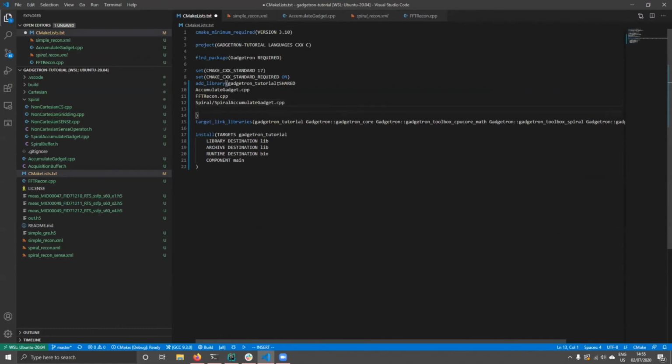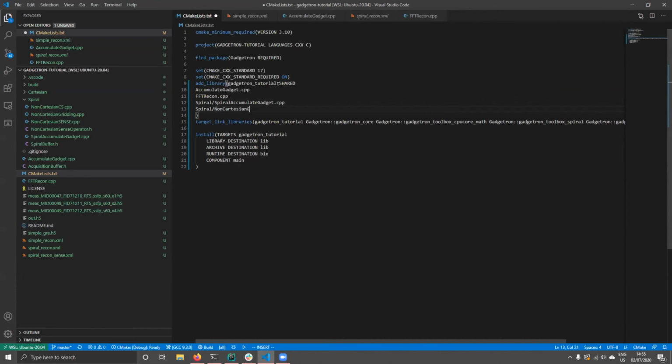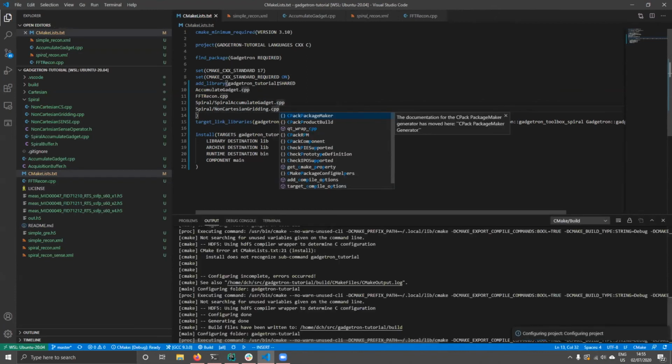For my day-to-day work, I would typically be using CLion rather than Visual Studio Code, but CLion is a pay-to-play sort of thing. So I wanted to use this to give you a good option if you can't get CLion. I do believe they have free academic licenses. One of the things CLion does is it autocompletes a lot better in CMake. So let's add non-Cartesian gridding. Okay, we're good to go.